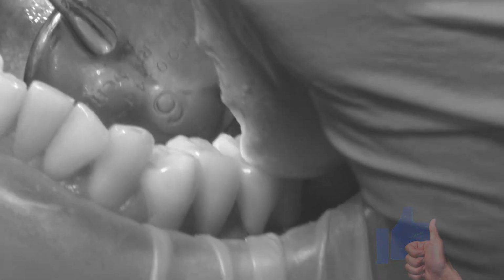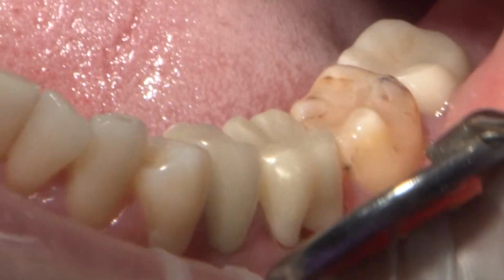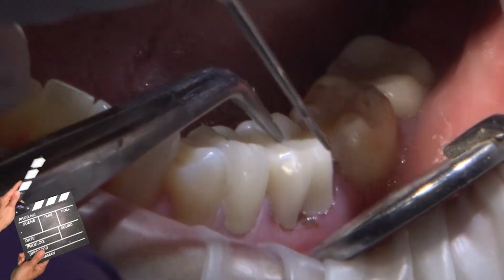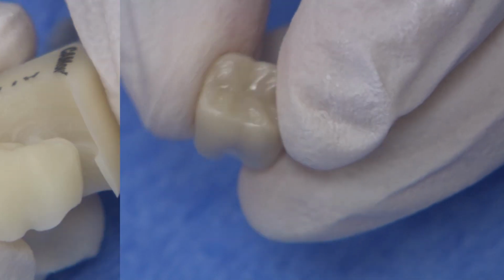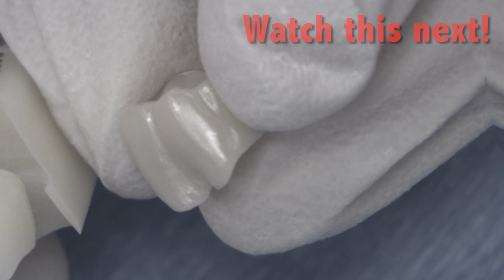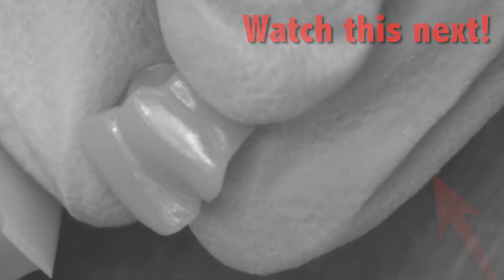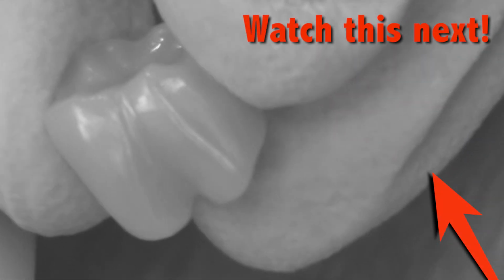And here is our BruxZir crown. Slides down into place. Hopefully y'all can see that okay. I'm just running along the margins here. Beautiful fit. Slow the speed down a little bit once you near the body of the crown. The majority of these restorations, look how shiny it is versus the camouflage that I just milled out. You can see right out of the mill, it has a pretty good shine already on it. So I, in most cases, just go ahead and cement it like that.